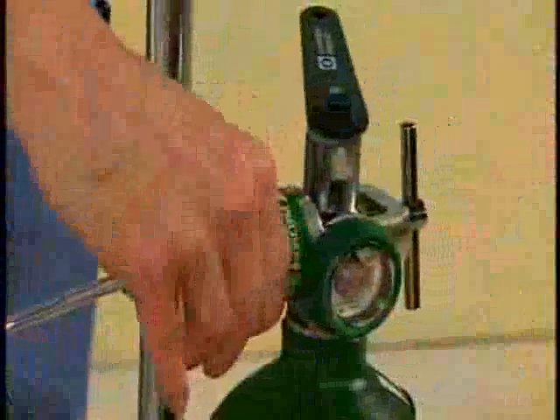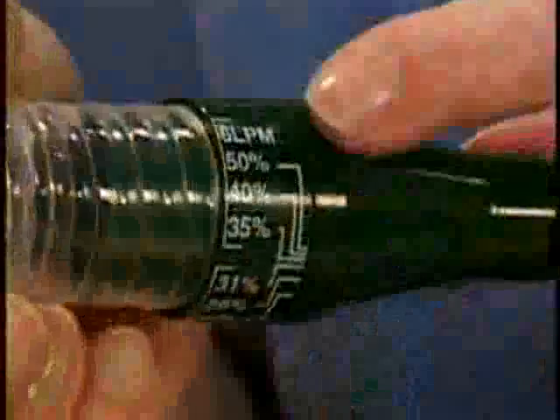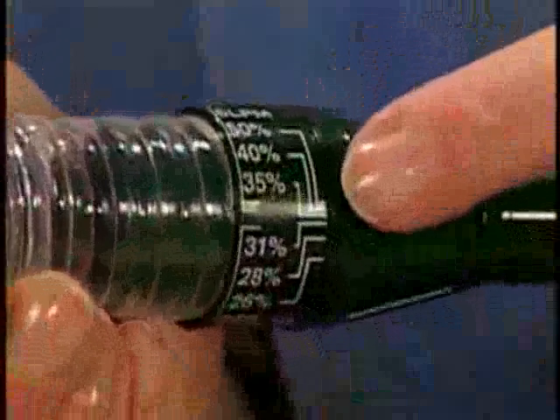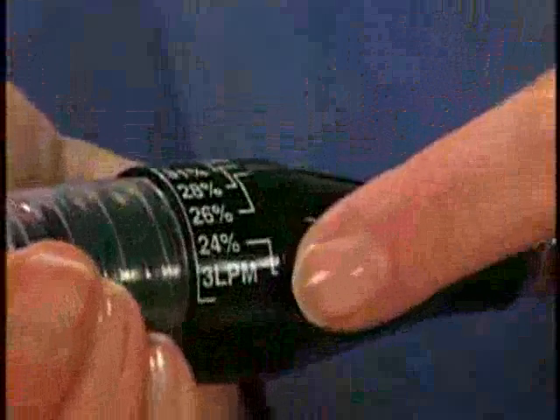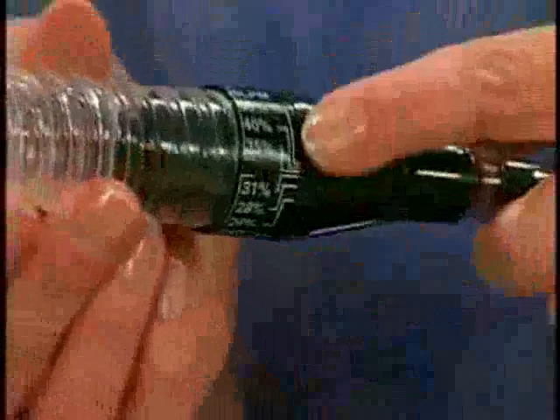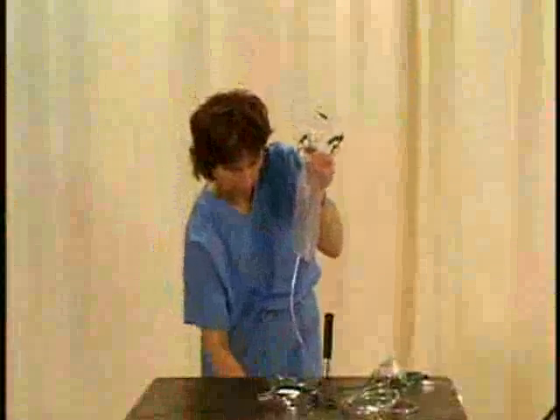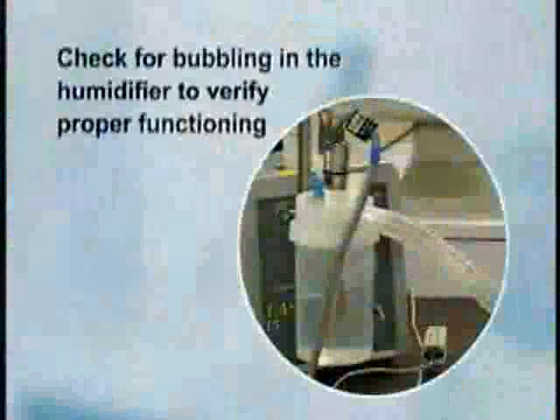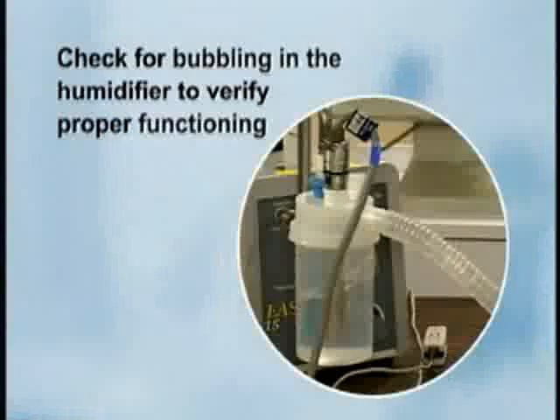Follow the same procedure, then attach the appropriately sized mask or face tent to the oxygen tubing and turn on the flow meter to the prescribed flow rate. The high-flow device will have color-coded inserts that list the flow rate necessary to obtain the desired percentage of oxygen. Allow the reservoir bag of the non-rebreathing or partial rebreathing mask to fill completely, and check for bubbling in the humidifier to verify proper functioning.